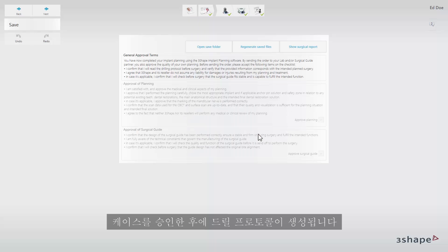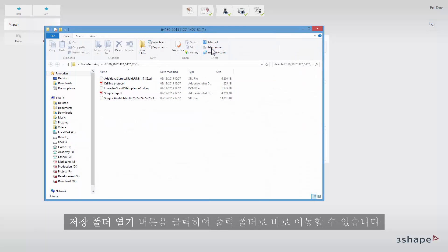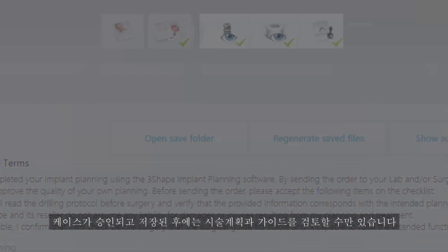A drill protocol will be generated after you approve the case. The order will be saved and the output will be generated. You can navigate directly to the output folder by clicking the open save folder button. This includes the drilling protocol, the surgical report, and the STL file of the guide. After the case has been approved and saved you are only able to review the planning and the guide.